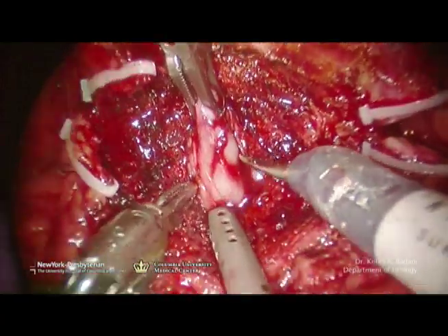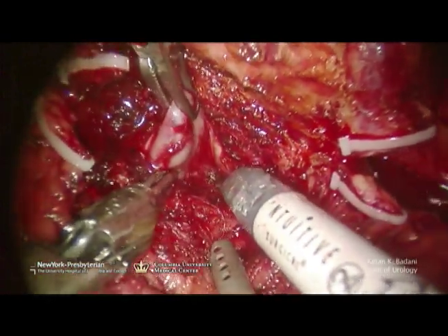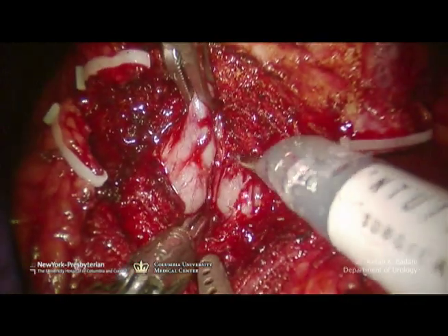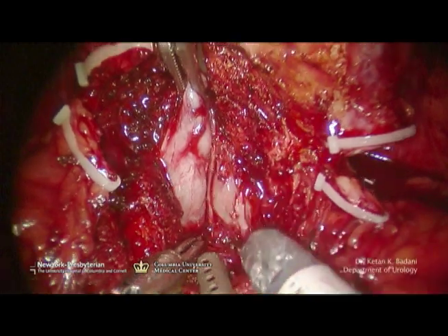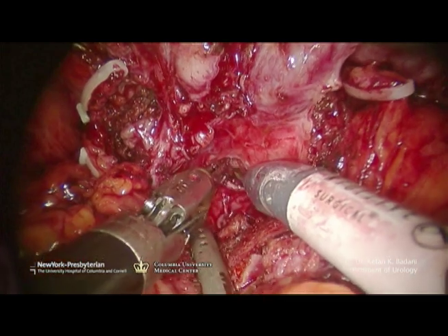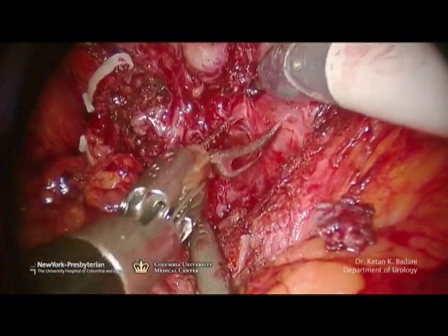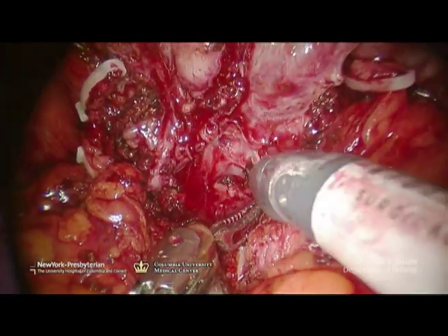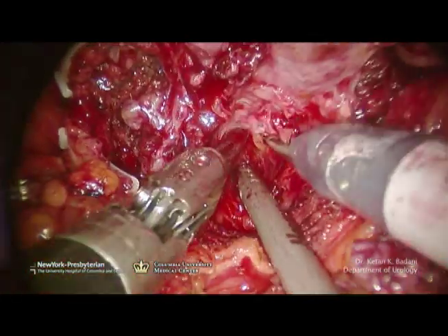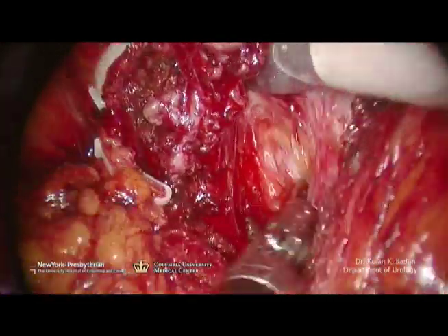Seminal vesicle dissection. Here the vas deferens have been further dissected, and the left and right vas deferens have been identified. Creating a plane in between the two vas deferens and the seminal vesicles to further elucidate the anatomy. Posterior Denonvilliers is grasped, and an incision is made approximately one centimeter below the base of the vas deferens. The perirectal fat is visualized and used as a plane. At this point, two planes can be developed: one between Denonvilliers and rectum, or one above Denonvilliers, between the capsule of the prostate and Denonvilliers fascia.